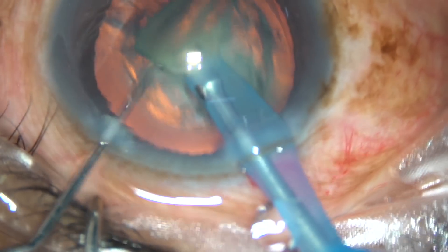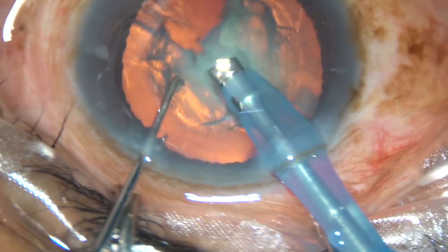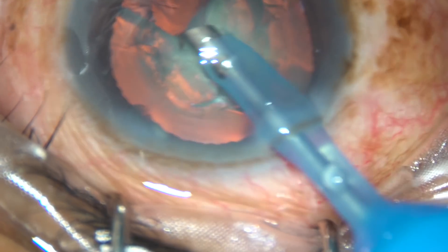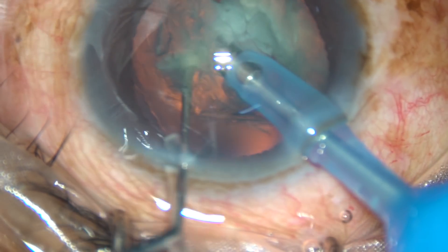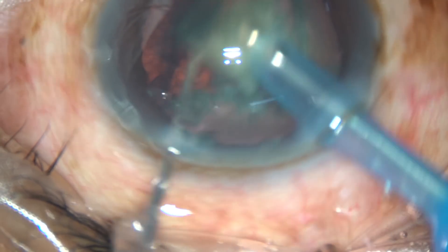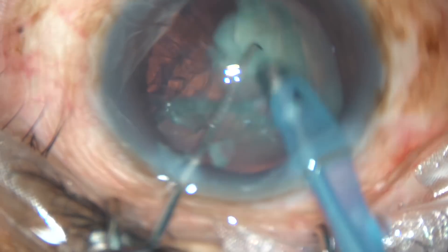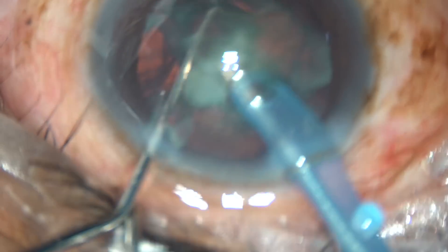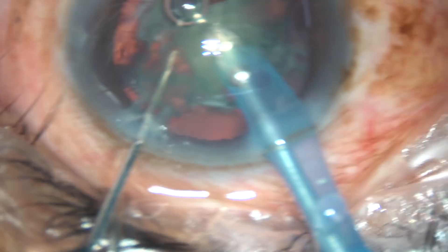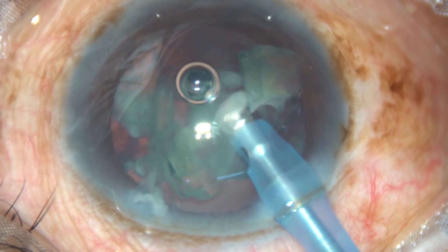This free nuclear fragment is emulsified and removed. So, without rotating the nucleus, we just removed a piece. Now the tip is turned towards the left side, and this portion of the nucleus is sealed. This is a chop at 3 o'clock and another piece is removed. I turn again to the right side and find that the nucleus is moving. So by this time, hydro-dissection has been done by natural movement of the balanced salt solution inside the anterior chamber and within the capsular bag.